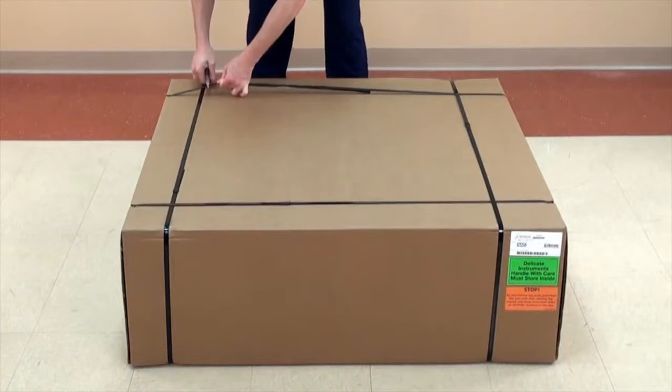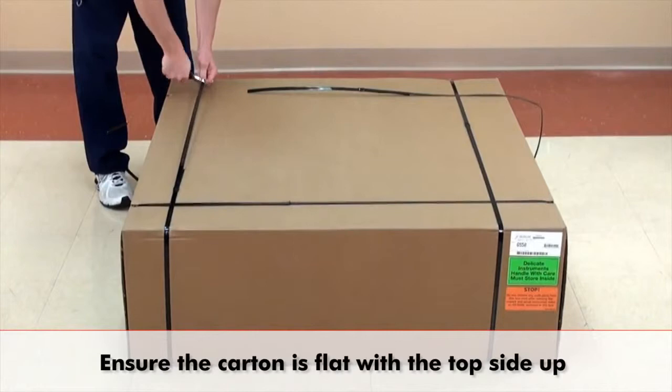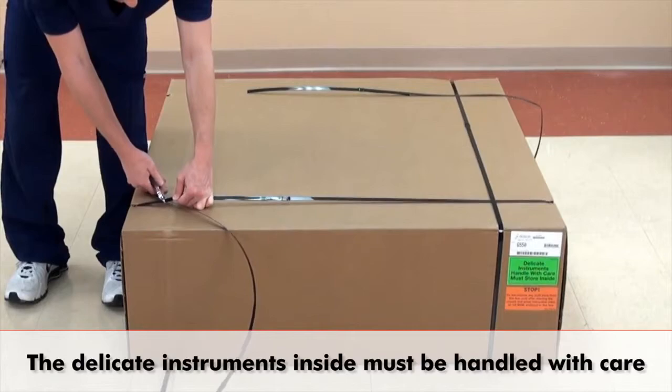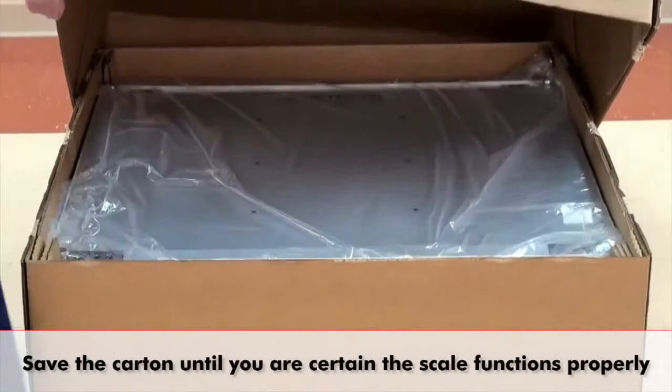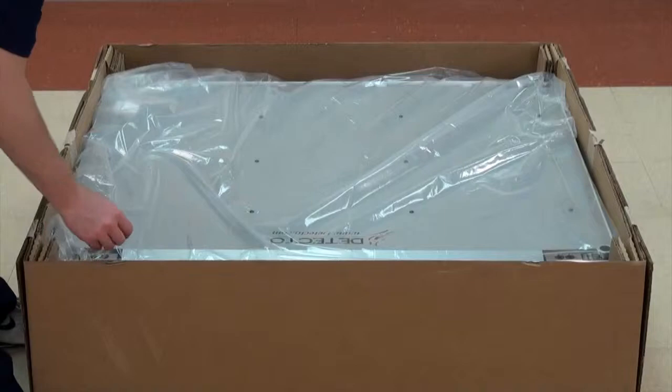It comes fully assembled except for attaching the digital weight indicator. Before opening, ensure the carton is placed flat with the top side up. The carton contains delicate instruments and must be handled with care. To open, lift the top off and set it aside. Save the carton until you are certain the scale functions properly, approximately 2 or 3 weeks.